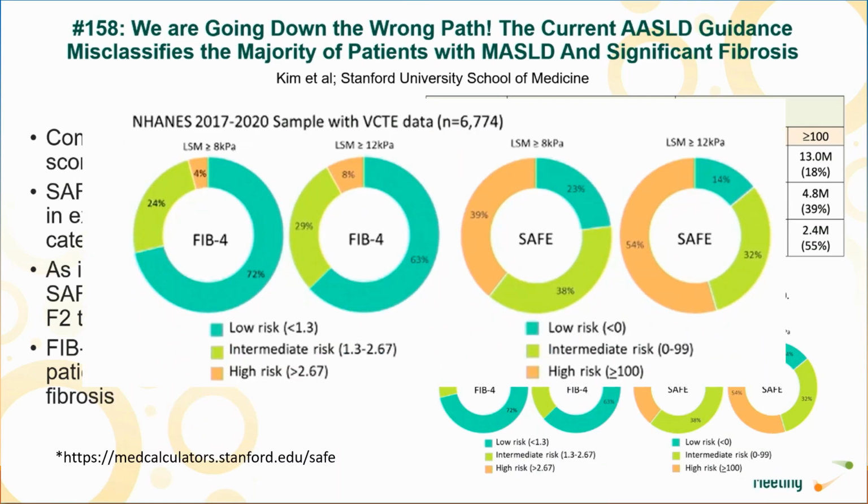So among about 2,700 patients meeting criteria for MASLD, in whom both FIB4 and Fibroscan data were available, the majority of patients with an elevated liver stiffness implying either significant or advanced liver disease had a low FIB4 score.